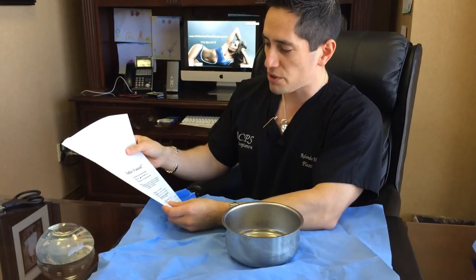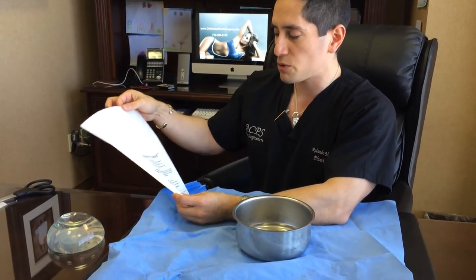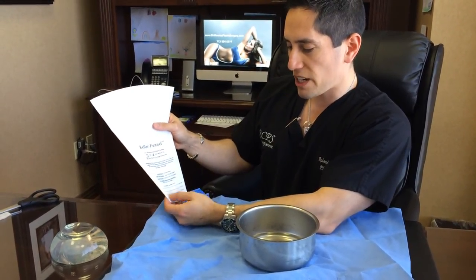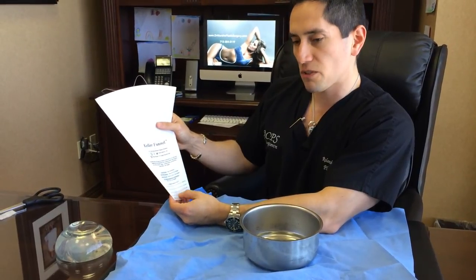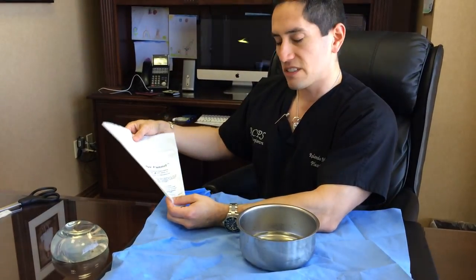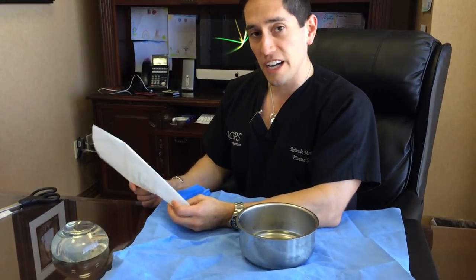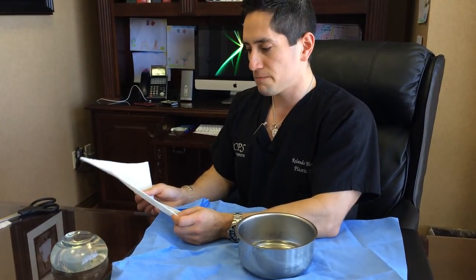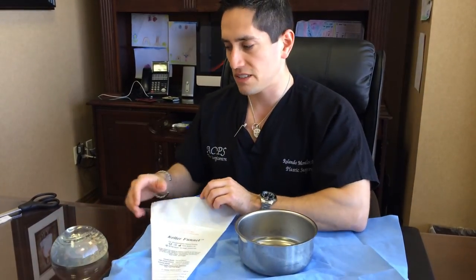This is a first generation product. The second generation is actually clear, and the fabric is a little more stretchy. This is the first generation. It has marks based on how big the implant is, based on volume, to facilitate the implantation for the breast augmentation. For me, I always use this for silicone implantation. I think it's safer, it speeds up the process, and again, it reduces the stress placed on the implant itself.